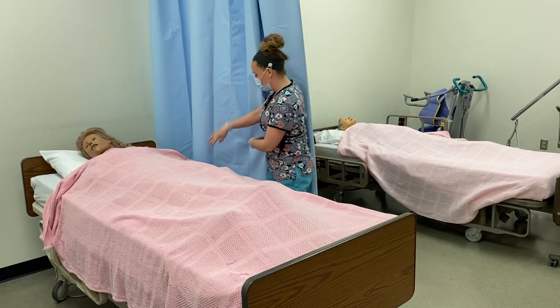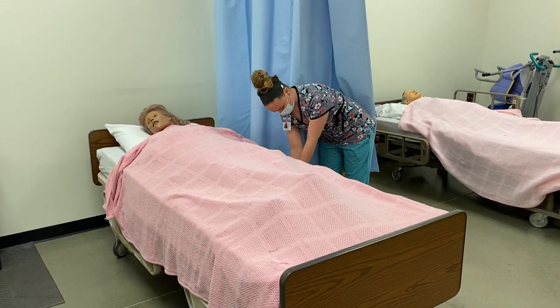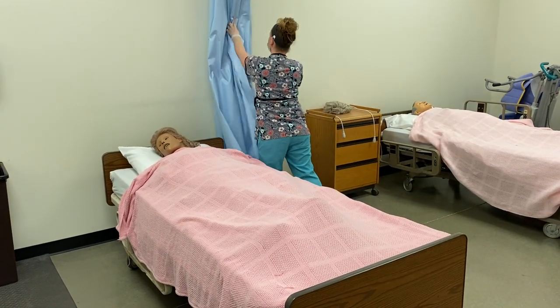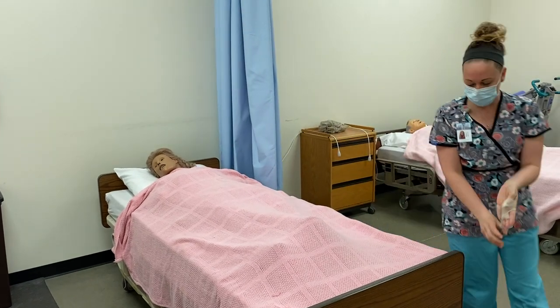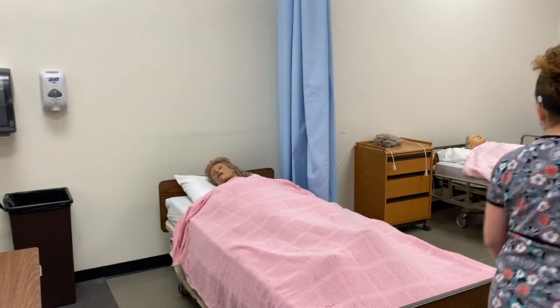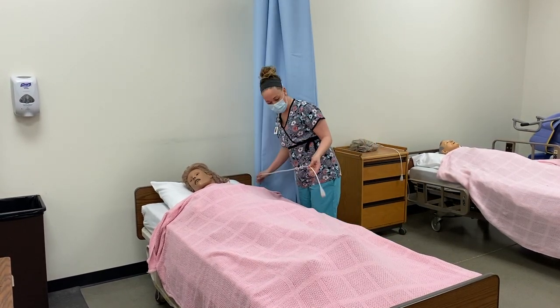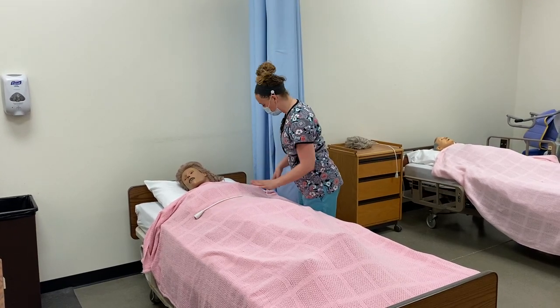Lower my side rail and her bed. I'm going to open up my privacy curtain and take off my gloves. Alright, we are all done — are you comfortable? You look like you're in good body alignment. Here's your call light; let me know if I can get you anything.